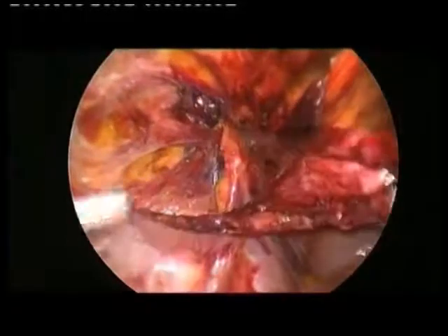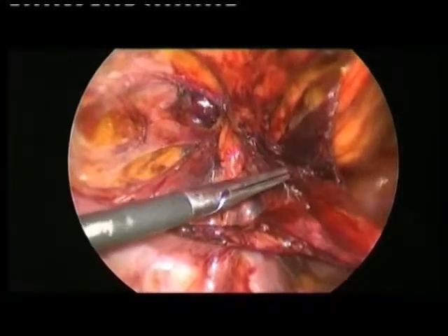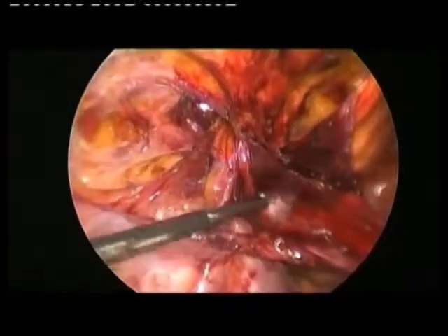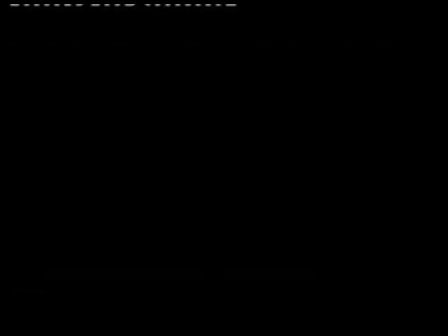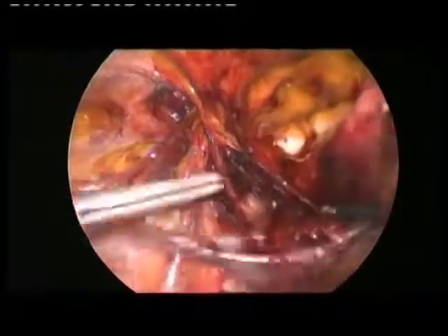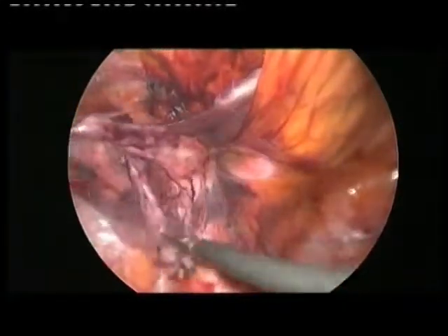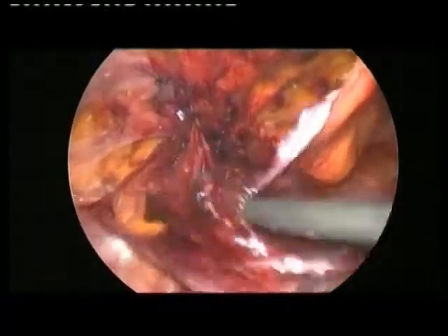We have to prepare 3-4 centimeters below the inguinal ring. I mean, from here, we have to prepare till here, because if you don't prepare this part, the incidence of hernia recurrence is high. So now we have reduced the sac, all the inguinal indirect sac, okay, you see?